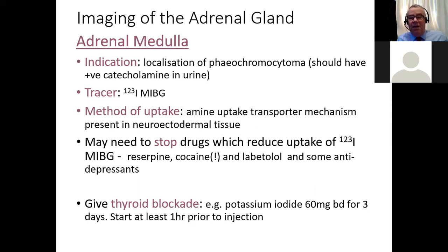So what about the medulla? Well, that's involved in the catecholamine system, and as we know, we can image that with SPECT tracers with MIBG, probably also with F18 DOPA and dopamine in PET, but it hasn't been used so much with these particular PHEOs. And from PHEOs, they tend to, as I say, class themselves as benign and malignant. I'll show you that in a minute.